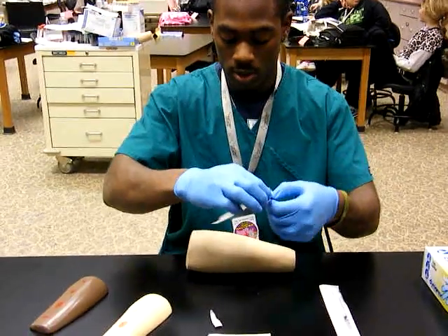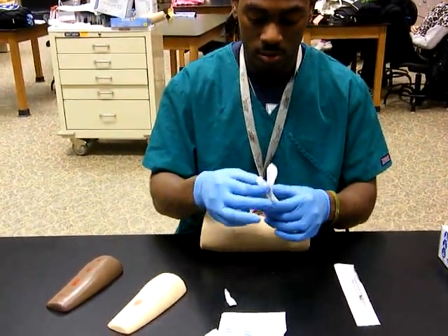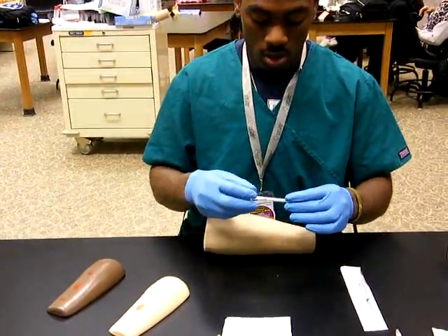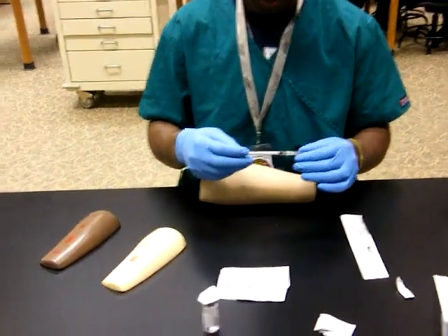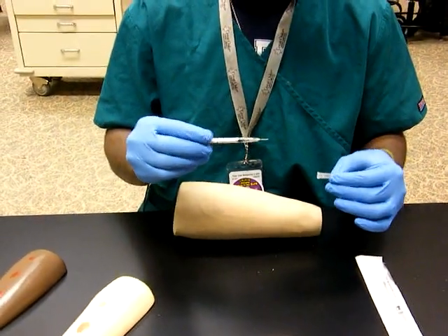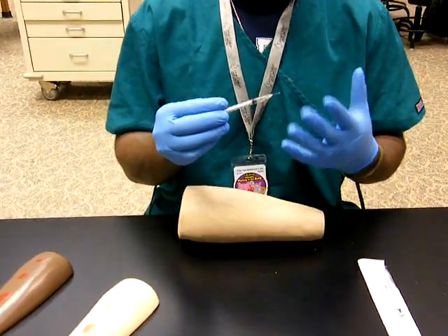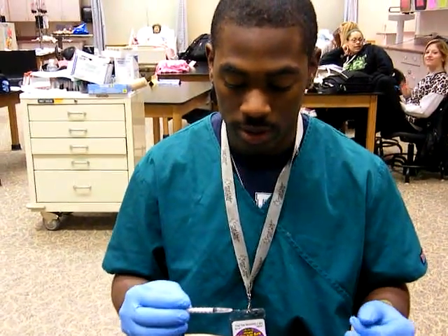Get your needle out. It's fresh, it's clean, it's sterile — do not let it touch anything else. You make sure everything is right: the plunger, the bevel, everything. Make sure it doesn't have anything sticking off of the needle, or any shavings, or anything like that.